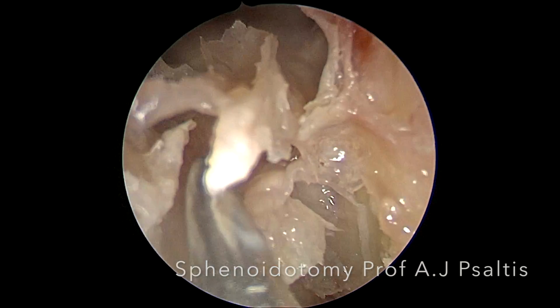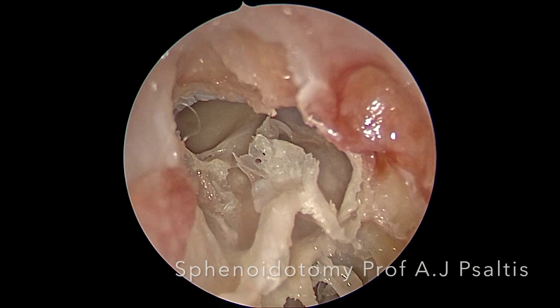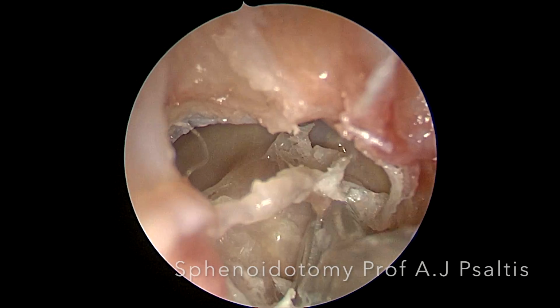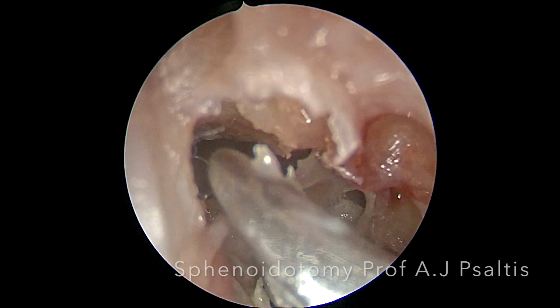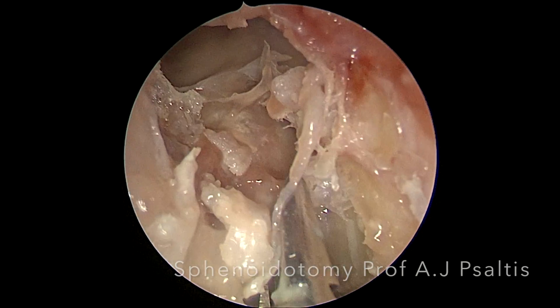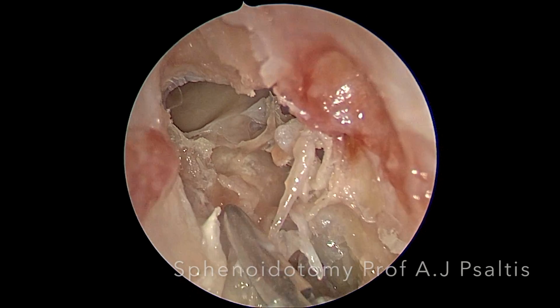Here we can see that we are using a 45 Blakesley to remove the bone from the partitions, and the soft tissue will be removed with the microdebrider. Generally, if you remove as many of these partitions as possible, you're likely to get a more complete clearance and a better outcome for the patient.